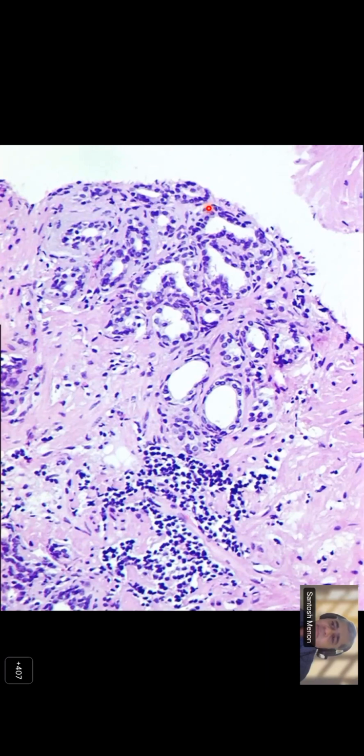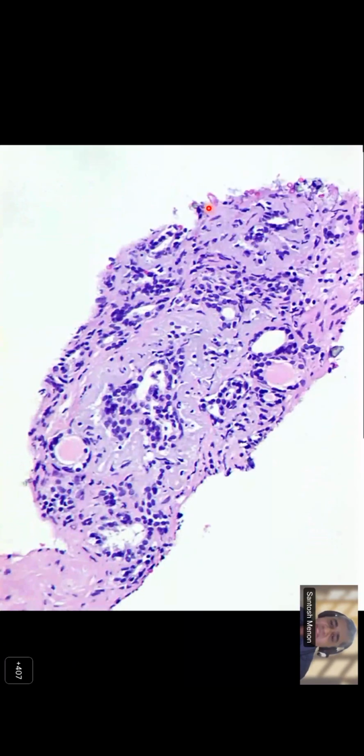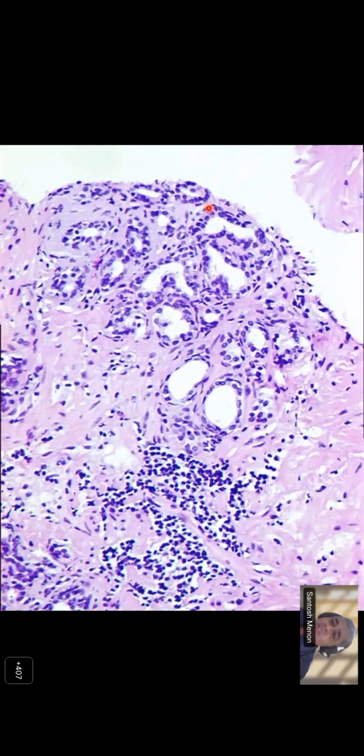I totally agree with Parul and Niharika and Poonam and all that. They are looking like glands which are small. They have rigid lumen. They are very rounded, small. So you do think that this might be a pattern 3 of prostate cancer. But then when you think of prostate cancer, you should always take into consideration that desmoplasia and stromal reaction doesn't occur. Inflammation doesn't occur. They usually have glands which are away from their family. And that's when you start seeing, obviously, the cytological features of presence of nucleoli.